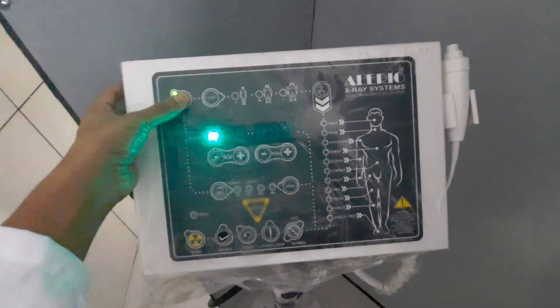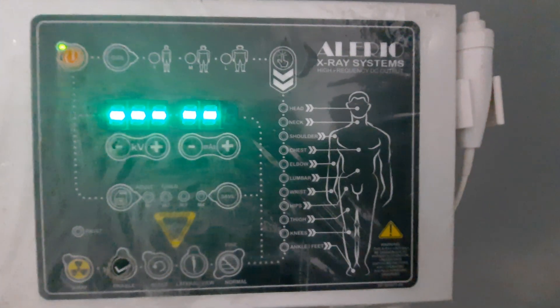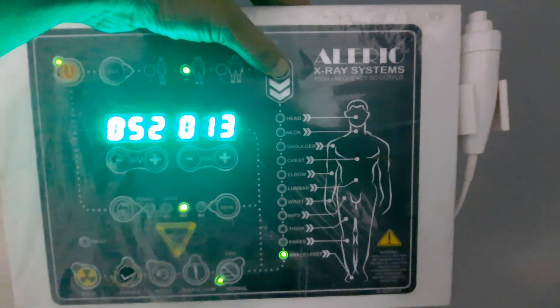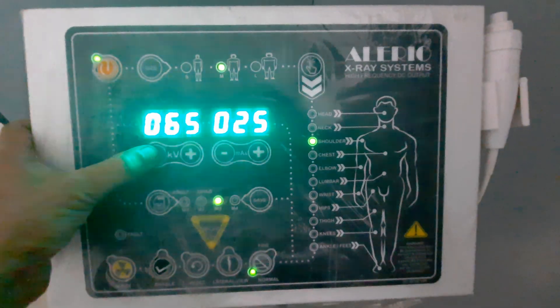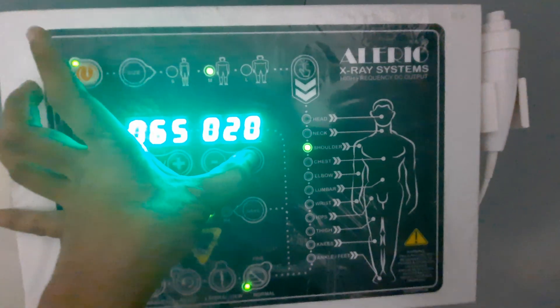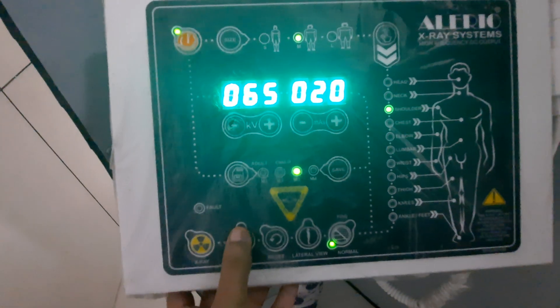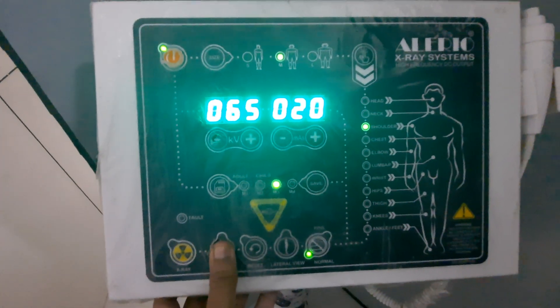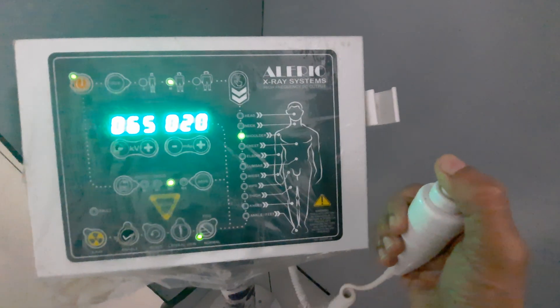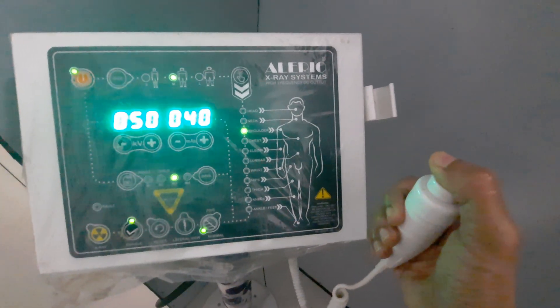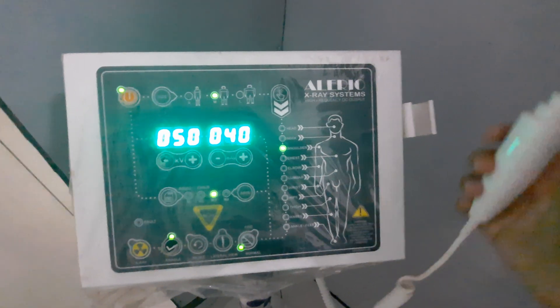This is the control panel. We press the on button to switch it on. In the control panel you can see different body parts listed, and we can select the appropriate body part. When the body part is changed, an automatic exposure factor is set, which can be reduced or increased based on the size and age of the patient. We press the standby switch, and when the x-ray tube is ready — indicated by the blinking stopping — we press once more to expose.